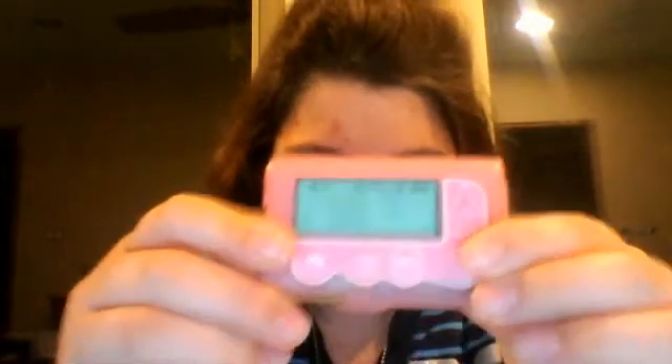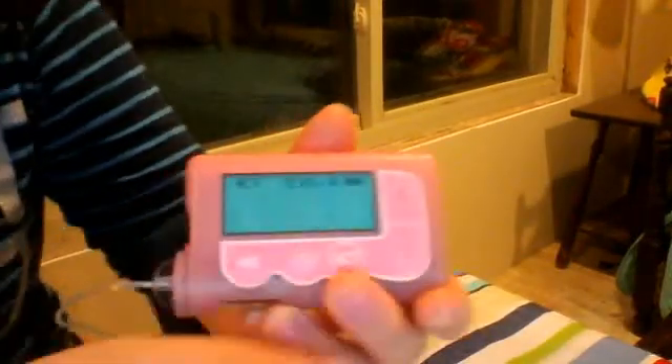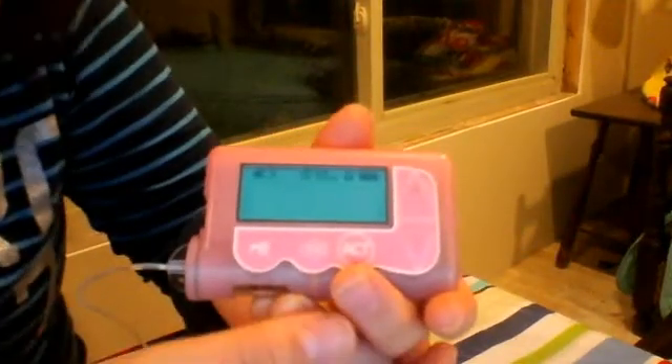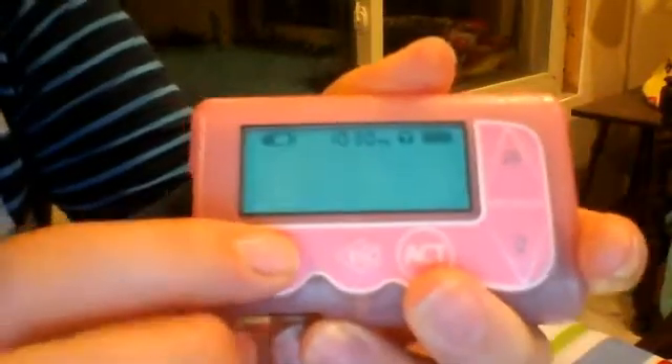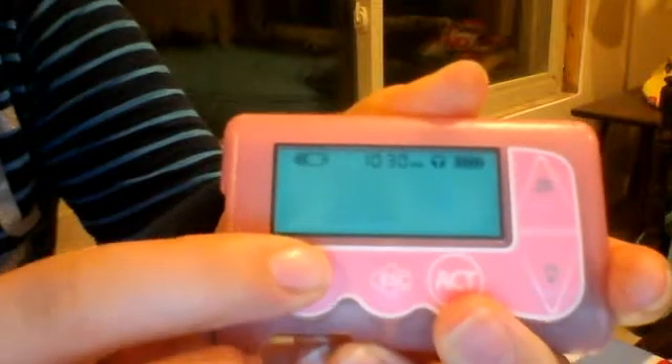The first thing is I'm going to turn on the light so you can actually see what I'm doing here. The first thing we're going to do — I hope you can see that clearly — is go to this shortcut bolus button, which is B.